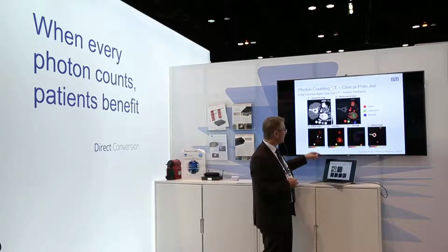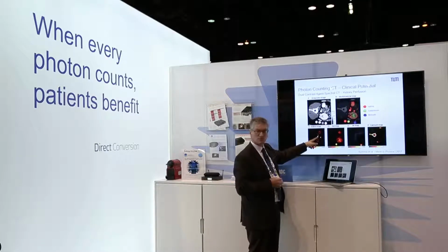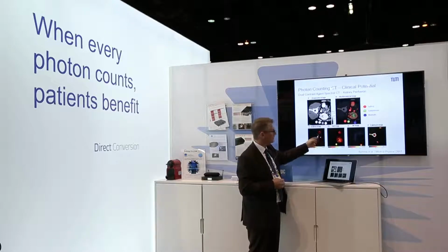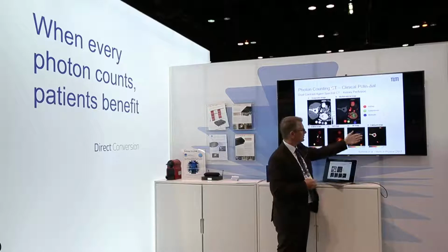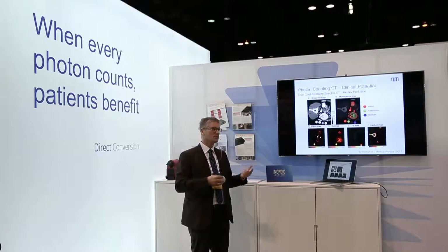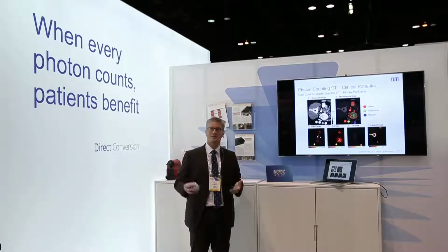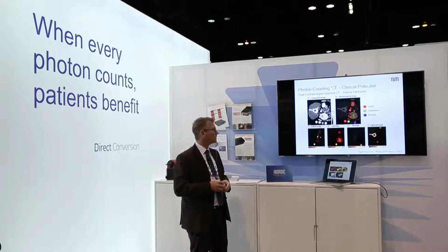And in the iodine image, you see from the aorta that you are in the early phase and you see some uptake on the edges. In this case, one could also separate a bismuth map where there's nothing in there, and calcium. So you see with one scan, you can differentiate and get the different phases for different organs, which could be quite interesting in the clinics.